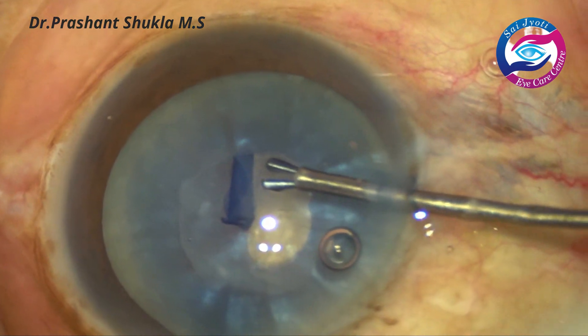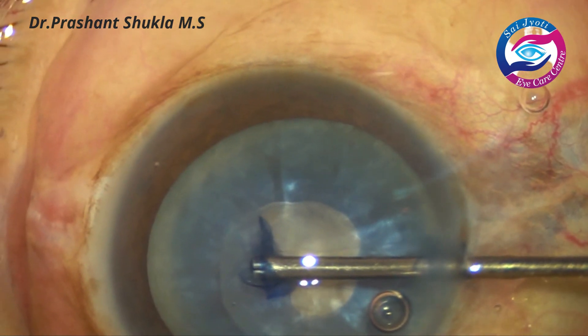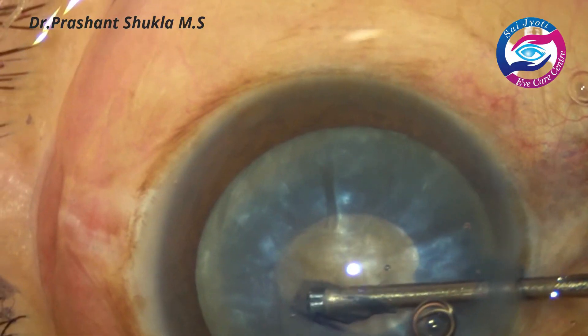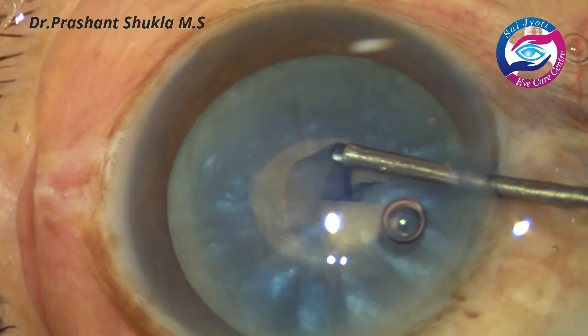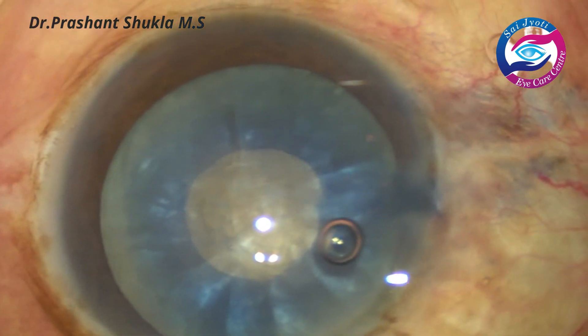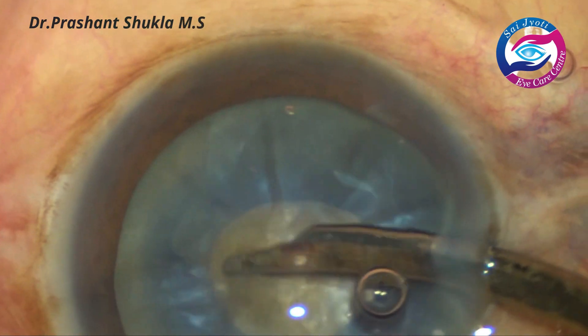This whole video is a set of many surgeries which have been cut and edited, and here I am doing a small continuous curvilinear capsulorhexis first using a cystitome and micro capsule rhexis forceps.